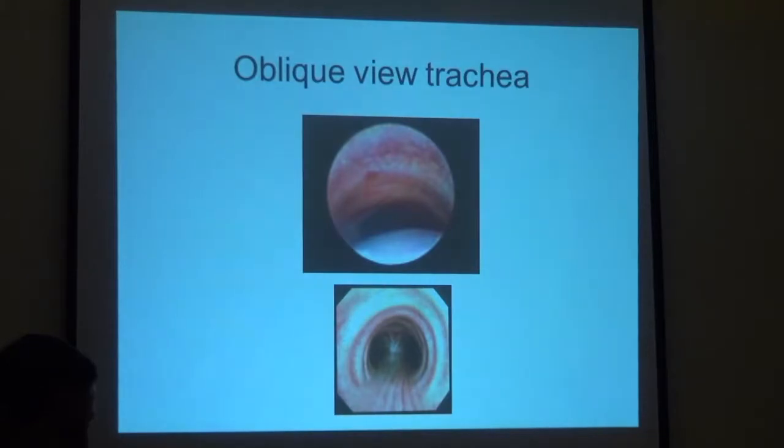Once you're in your trachea, all of this is two, this is the up. And for three, you would have to turn your scope all the way, so this will be flipped, and you puncture here. Extremely rare. It's very rare. Mostly esophageal cancer related, not lung. There's no drainage there. I've never seen it with lung cancer.